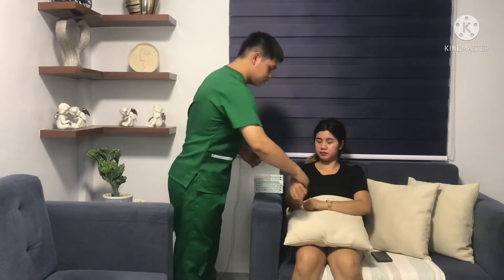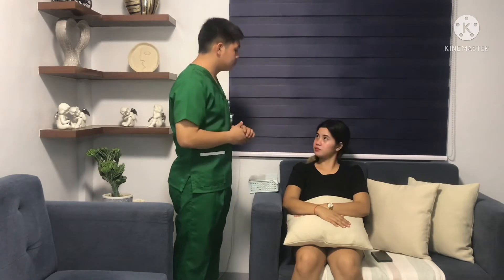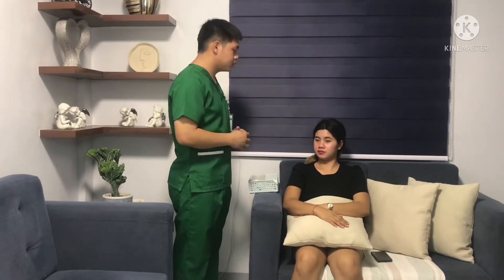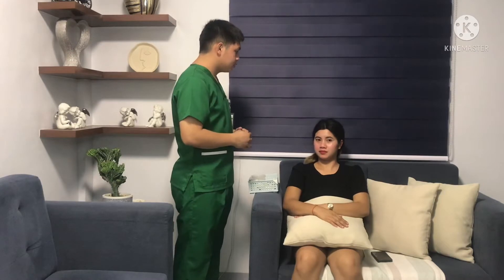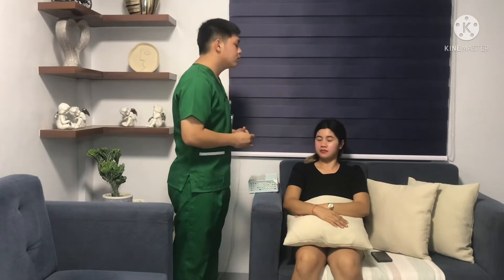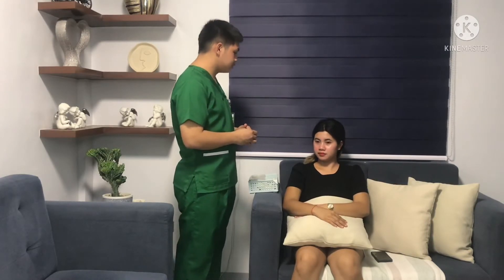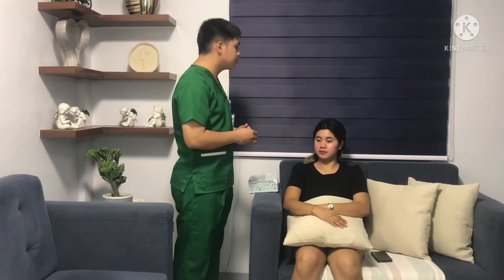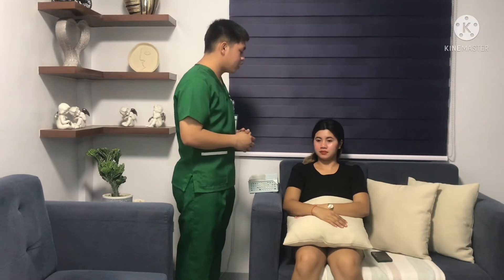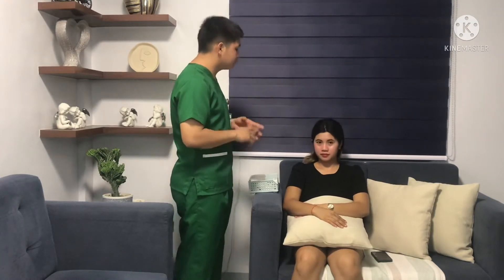Confirm the patient ID using two patient identifiers, which are the name and the date of birth. Explain the process to the patient and ask if they have any questions. Blood glucose monitoring reveals individual patterns of blood glucose changes and helps in the planning of meals, activities, and when to take medications. Also, it helps to prevent complications of hypoglycemia and hyperglycemia.